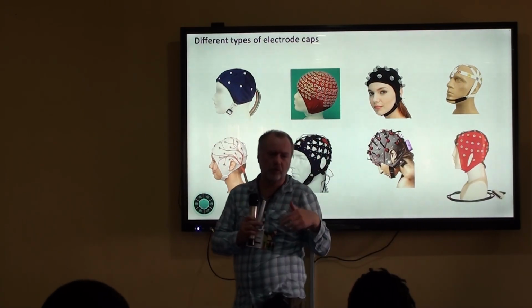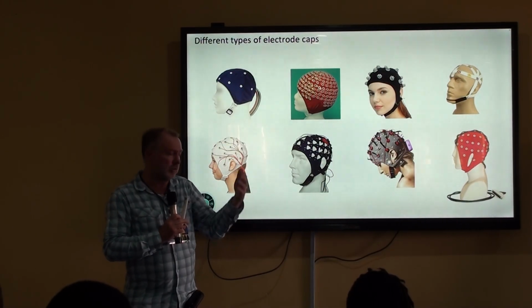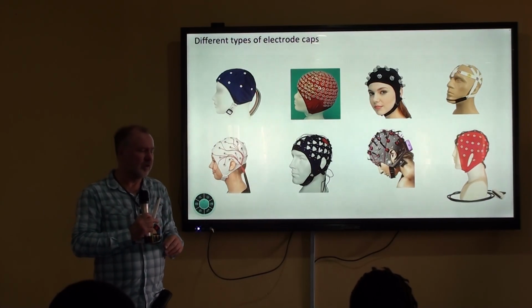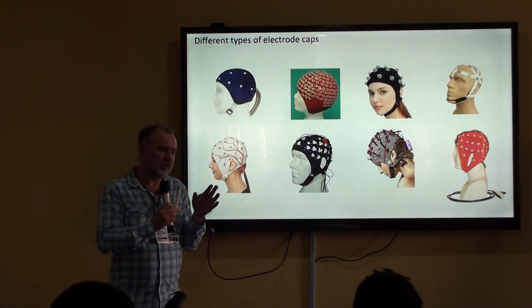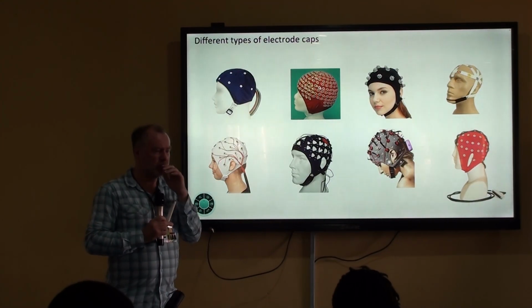It's more like, what do you consider optimal for a certain scenario? And for a home scenario, I would say dry electrodes are really optimal. But for a research scenario where you have a researcher and a research assistant, then you can use something else. So there's not one optimum, because it really depends on how you're going to implement the system.